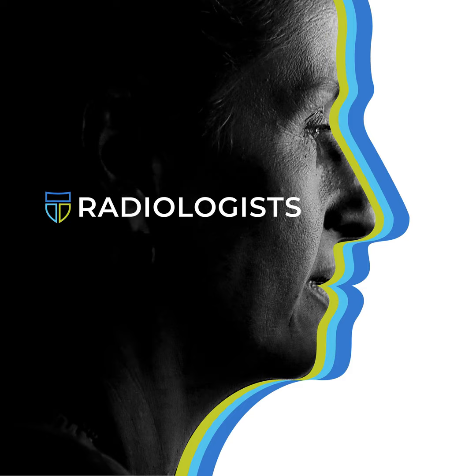The scan time as well. So usually it takes 45 minutes to an hour, whereas ultrasound you can finish in 30 minutes. It depends on what kind of ultrasound you are doing. And also ultrasound you can do as many times as you want. You can follow up every 2 days, every 3 days, right? MR is one stop. Then maybe in 3 months, maybe another MR, if possible at all, right?